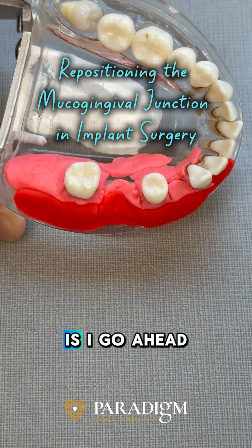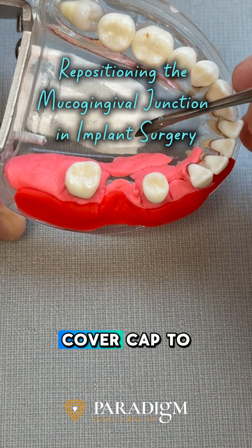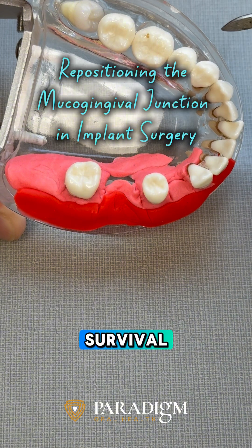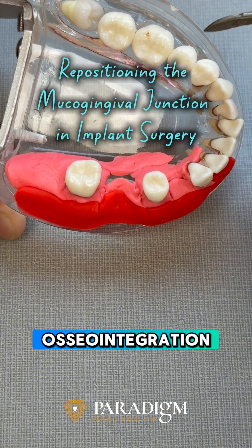So sometimes what I do is place an immediate implant and then bury it with a cover cap to maximize the chances of survival while minimizing other factors that may compromise the osseointegration of the implant.